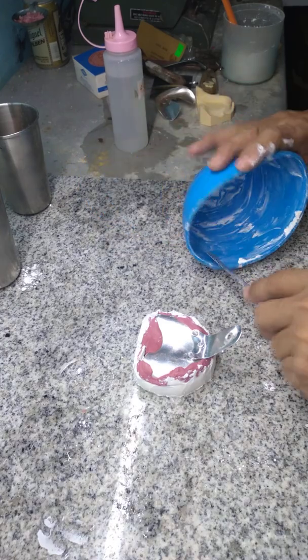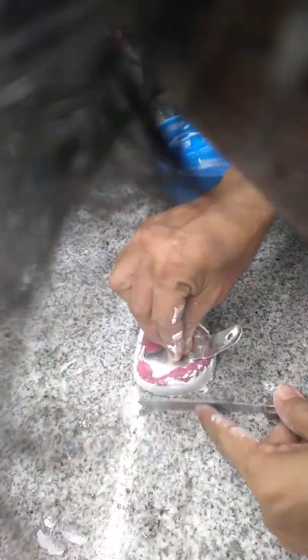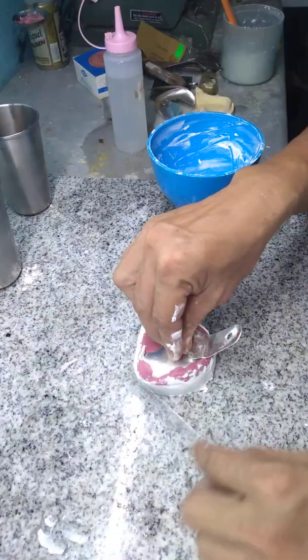You don't need a very large base — just enough to cover your impression.